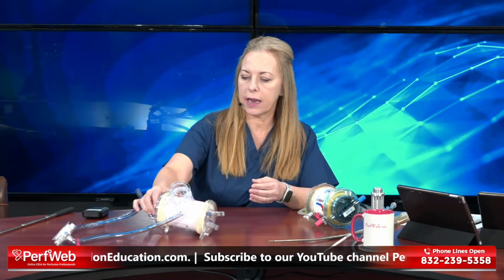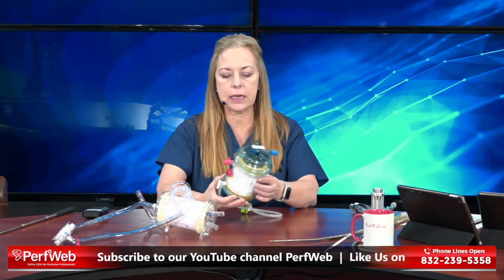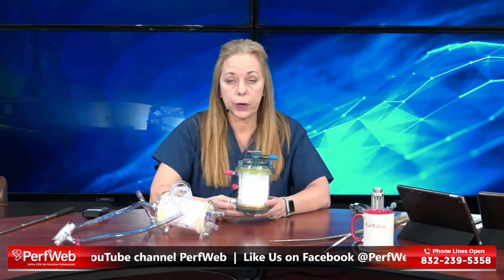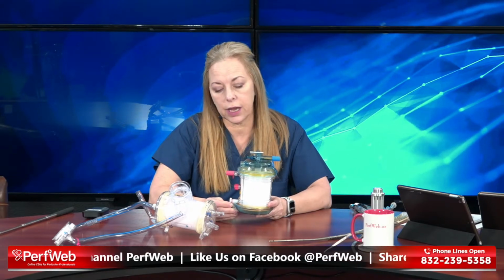Okay, then we also have another oxygenator. This is also made by LivaNova. This is their EOS, and this one is considered the real long-term oxygenator. Let's hold it in the right direction here. It's made of PMP fibers, which last much longer. They don't have the same interaction with lipids, so you have no concerns with that if you want to run propofol. And these we had last a really long time.